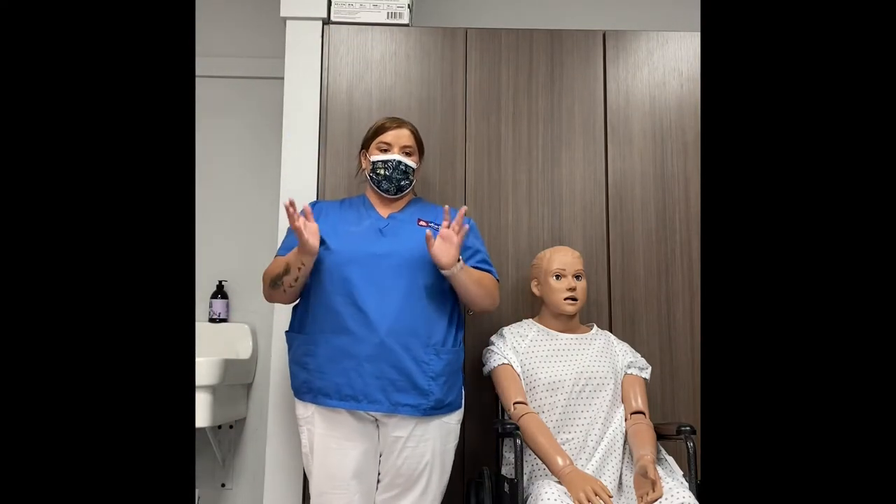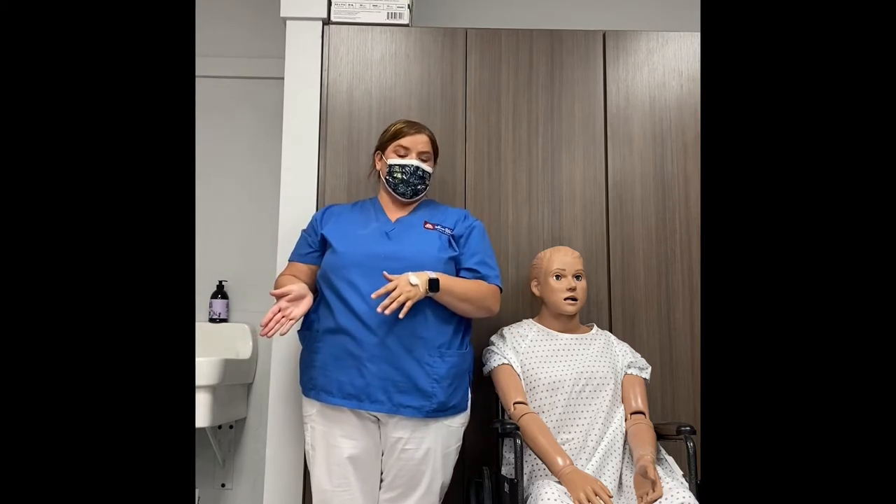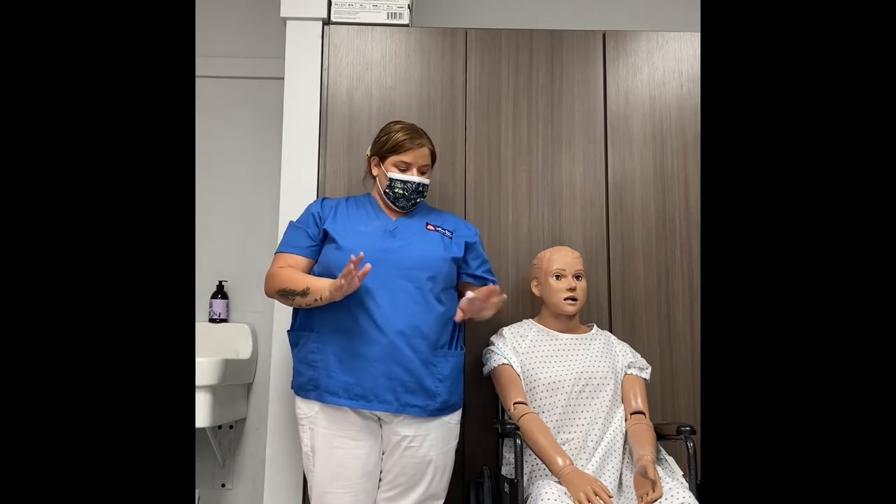In this video I'm going to demonstrate how to properly transfer a patient out of a wheelchair into a regular stationary chair. Once you have your patient and they're ready to be transferred, you want to make sure to follow the proper steps.